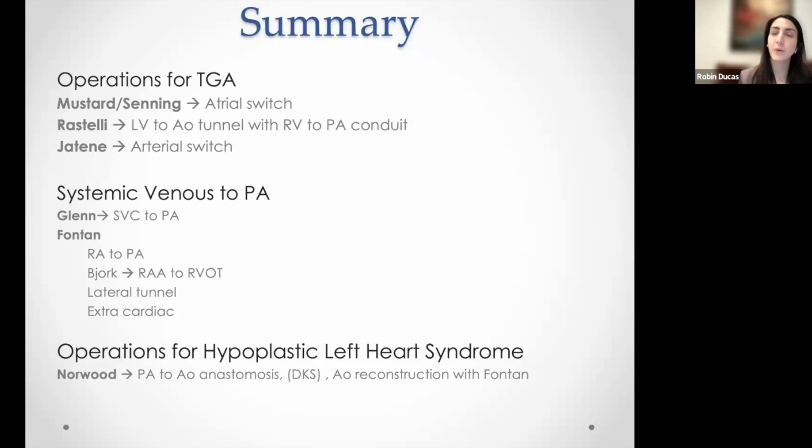So there were a lot of surgeries that we went through, and the hope is that this isn't going to be a completely comprehensive discussion about it, but just to go over as an overview the types of surgeries that are done and some of the key themes and things that we need to image when we're evaluating these patients to look for any long-term complications.